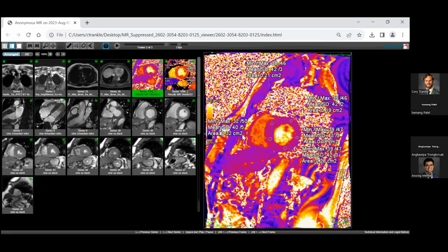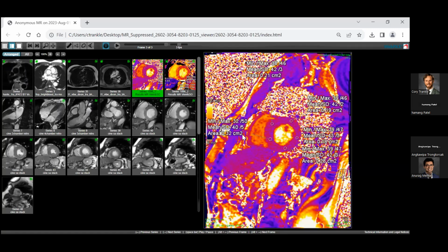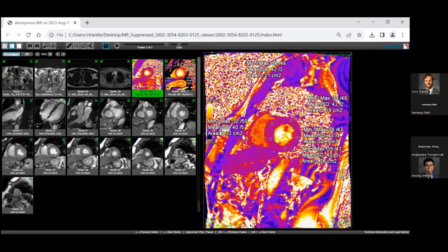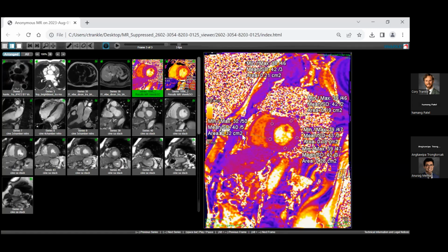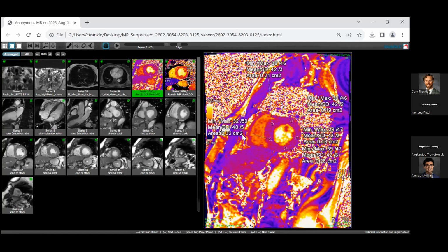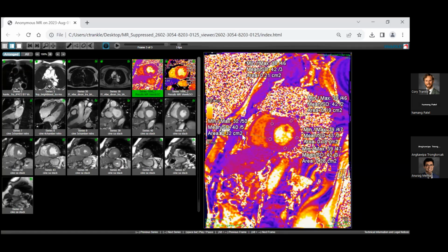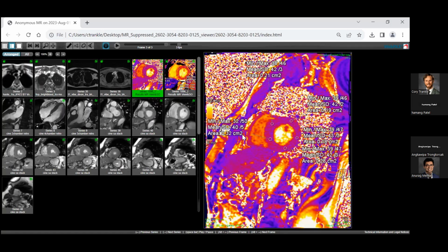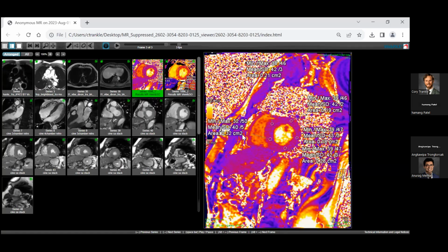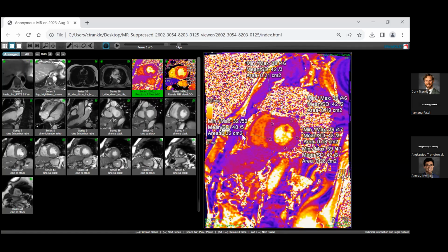It's 32 to 50, and you can see how that works. Now, something you want to remember about T2, why do we spend all this time doing this? It's because that is a really important piece of information. The T2 reflects a lot of the hydrogen bound to oxygen in water, okay? In water. So the T2 time, which is really interesting, reflects how much water is within the region of interest.